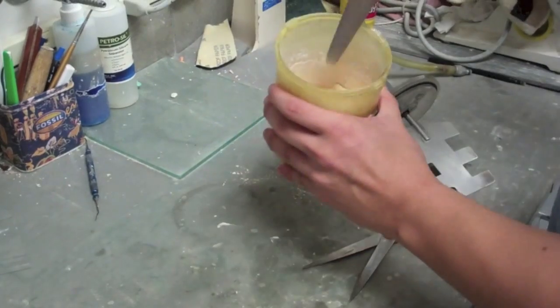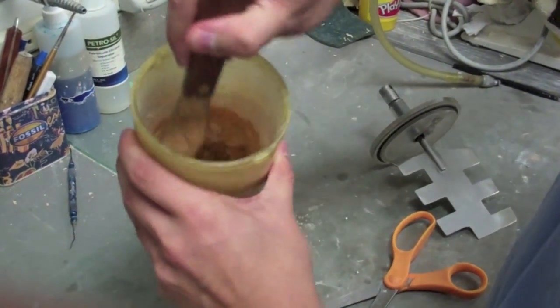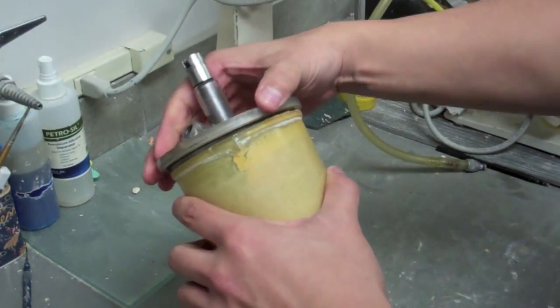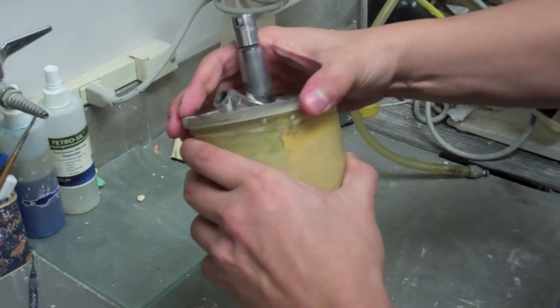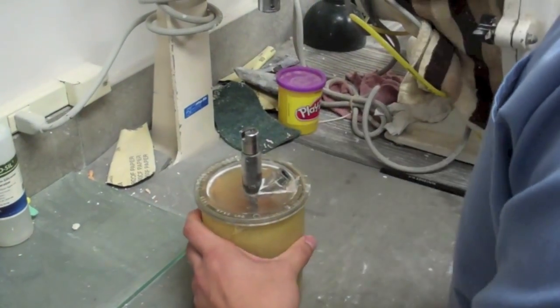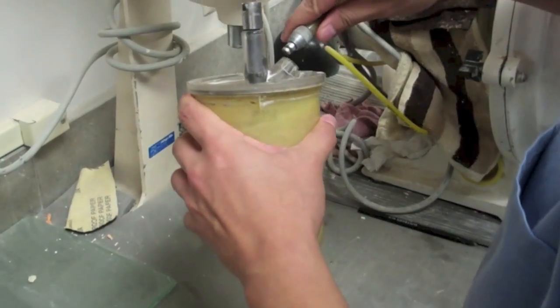Once the water and stone are inside the Wipmix bowl, you may mix lightly with a spatula. Once the stone is lightly mixed, you may place the lid on top of the Wipmix bowl. Once it is sealed, place the vacuum hose in the insert.